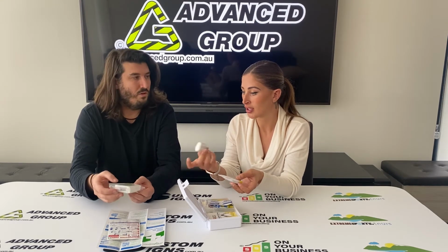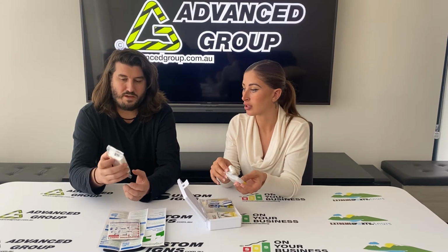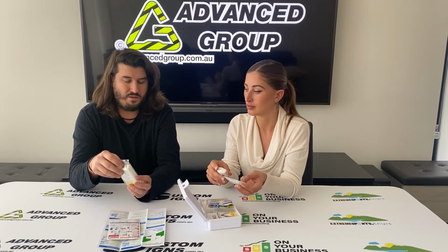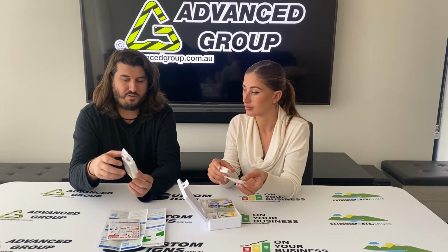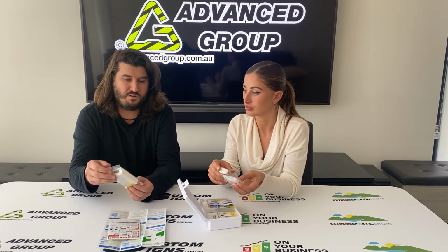I did open it and I didn't need it. Am I still able to keep it in there? No. So you would throw it out as soon as this package is open, because it would no longer be sterile. And then, there's always a risk that you use a bandage that isn't sterilised on an open wound that could cause an infection. Yeah.